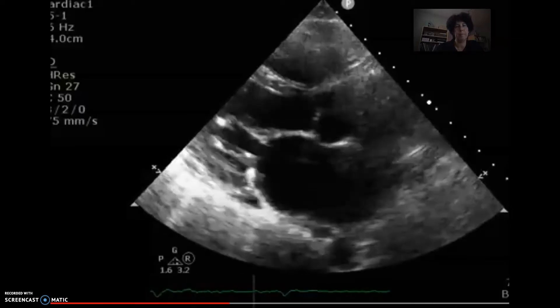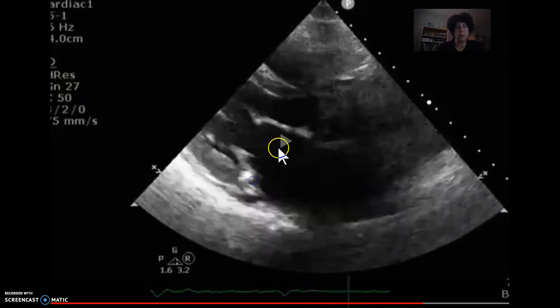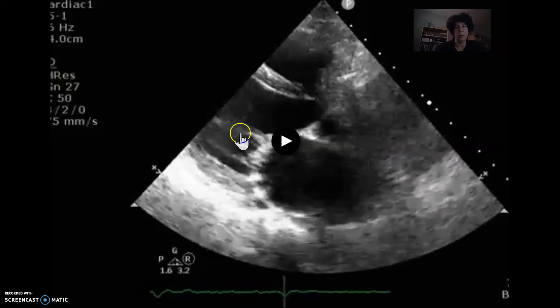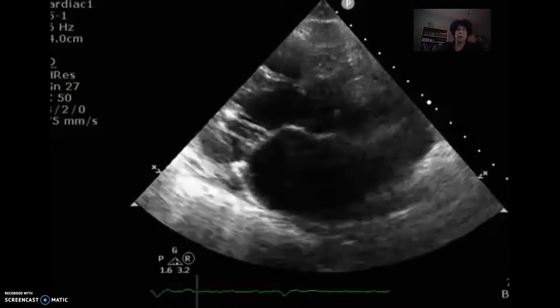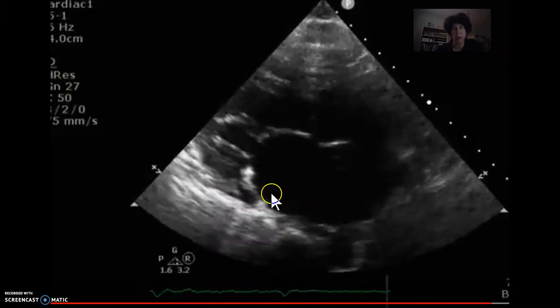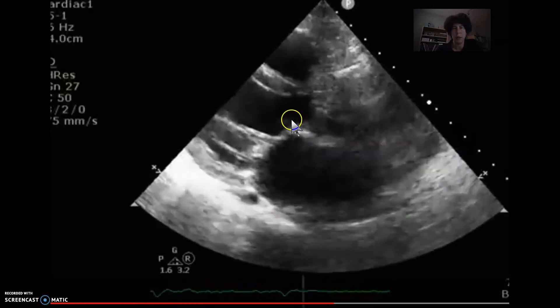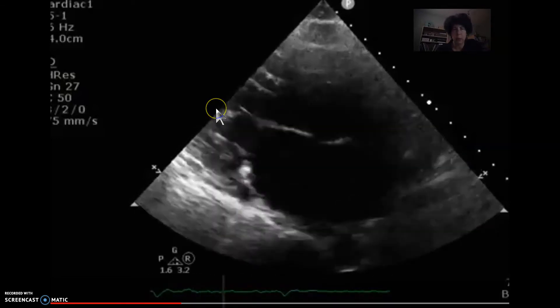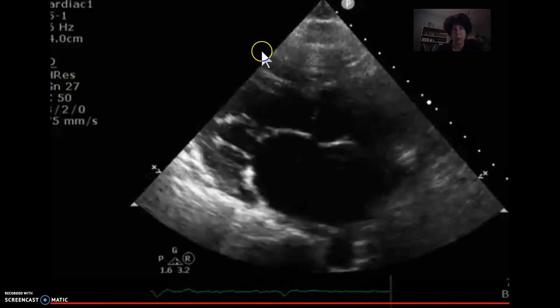Let's look at the images. Here's our first loop. First, we have to decide which view this is — this is a parasternal long axis. Think about which chamber this is: that's the left atrium, which makes this the mitral valve going into your left ventricle and left ventricular outflow tract. Here's the aortic valve going into the ascending aorta, and this is the right ventricle.